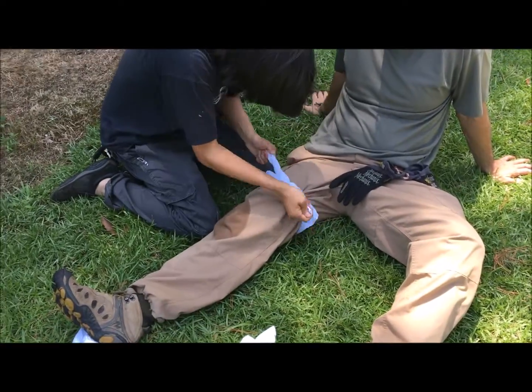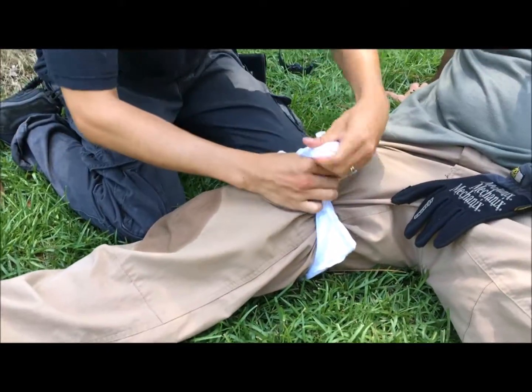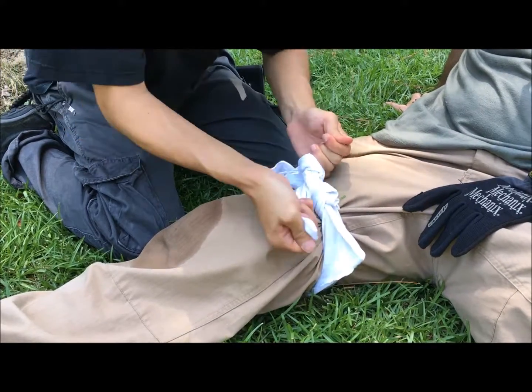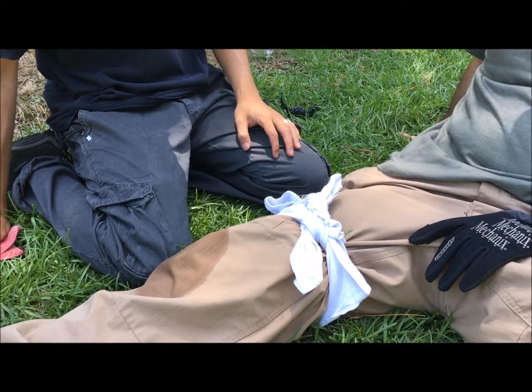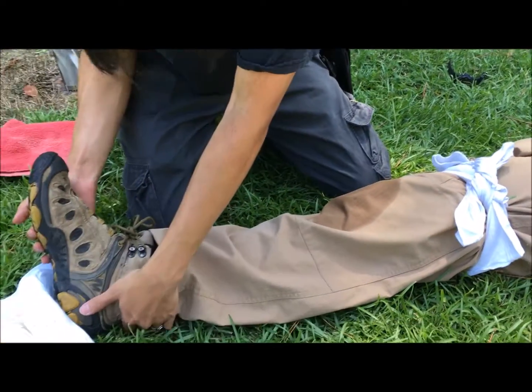Pull it pretty firm. You're not trying to cut off the circulation here, by the way. It's extremely important that you don't cut the circulation off, because this is not a tourniquet. This is your first dressing. You're going to leave this on here for 5 to 10 minutes to see if the bleeding actually stops. You're actually going to elevate the leg to 2 to 4 inches, so just very slightly. You can put it on your leg.